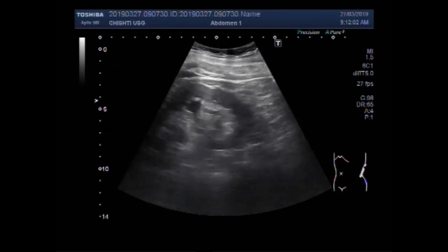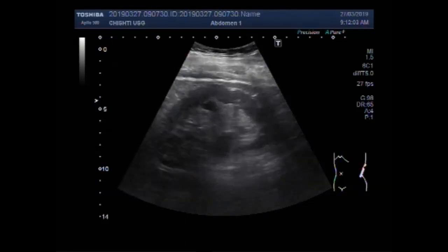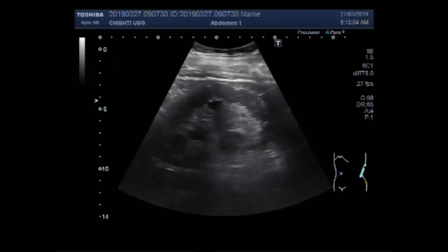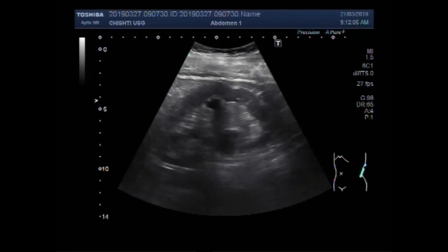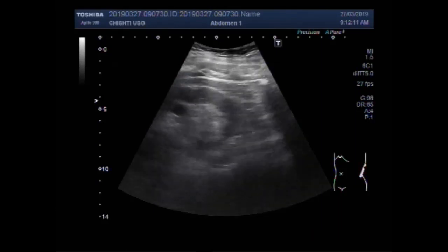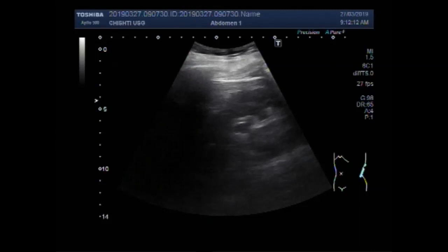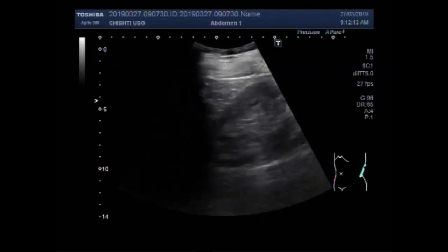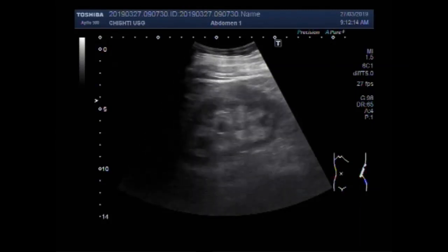You can see this is the left kidney. The pelvicalyceal system is dilated. There is hydronephrosis with hydroureter.